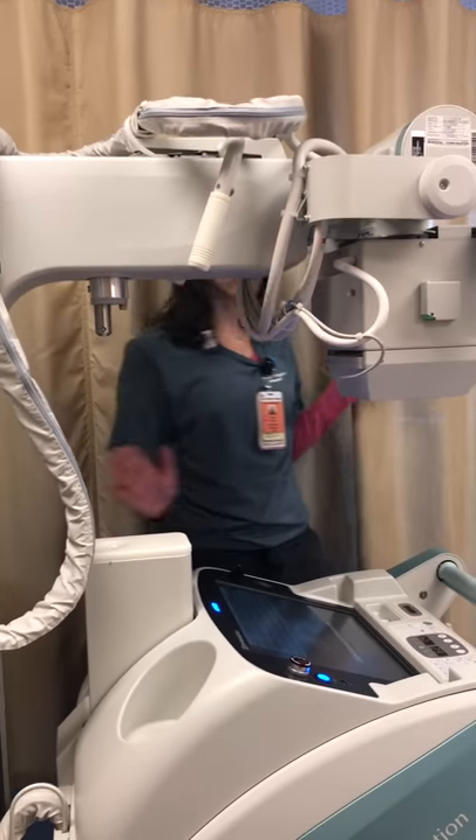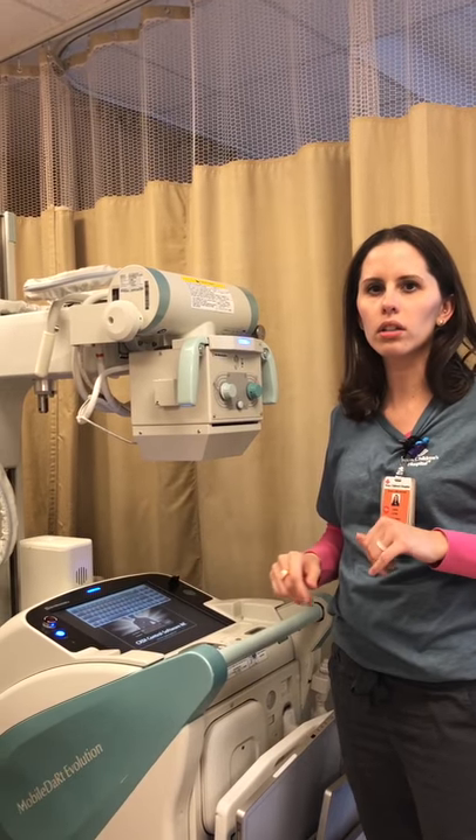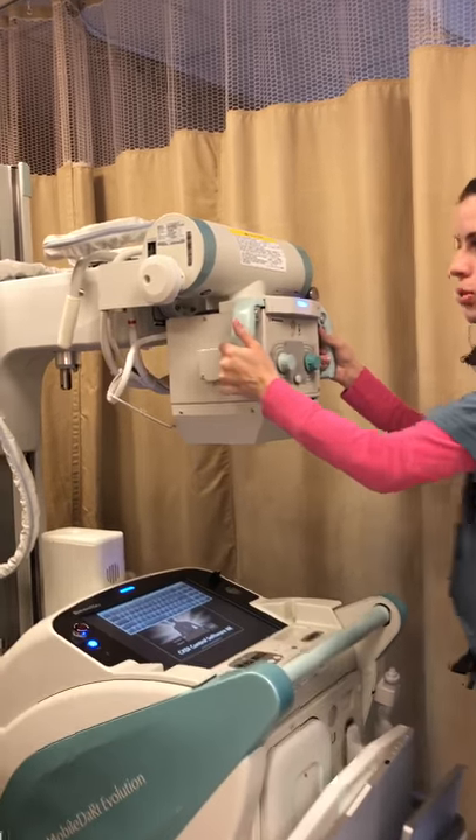Sometimes that does happen even to myself using the portable, so this is a really easy way — if it's just not unlocking, you can easily unlock it there. Sometimes they are a little hard to push down, but it will release the tower, the tube.